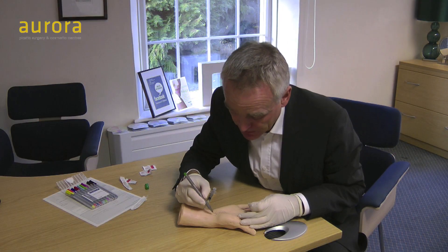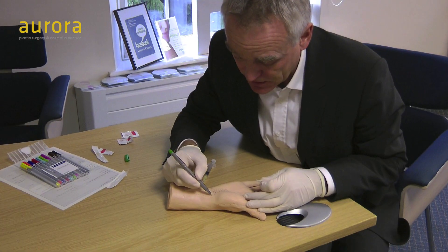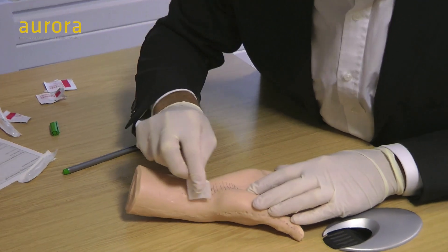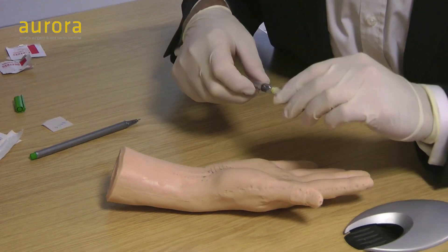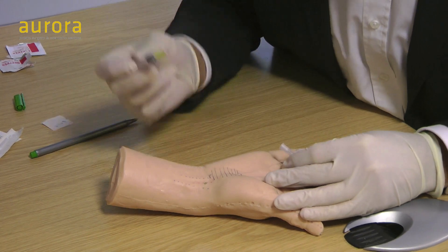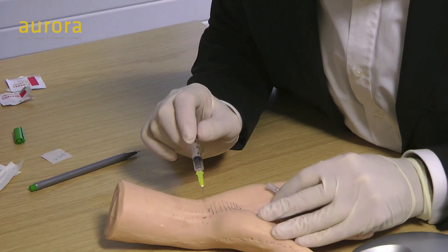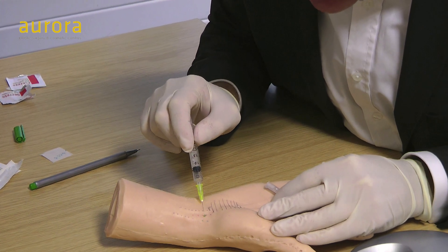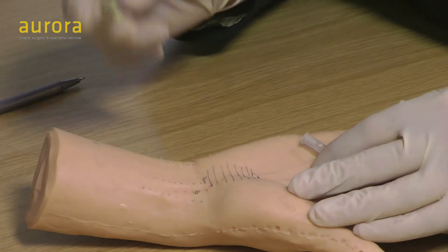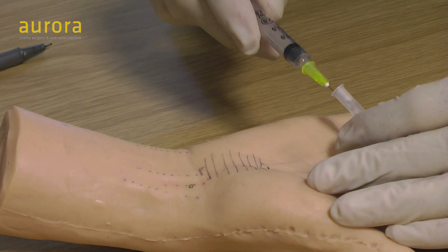The first stage is to mark where you want to inject — between the flexor carpi radialis and the palmaris longus, just there. Next, clean the skin with an alcohol swab so everything is sterile; use a no-touch technique to avoid introducing any bugs into the carpal tunnel. I like to give a little bleb of local anaesthetic first into the skin to reduce the pain during the procedure — just go through the skin with the lignocaine and raise a small bleb where you're going to inject.